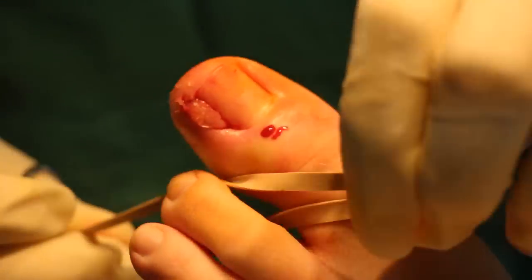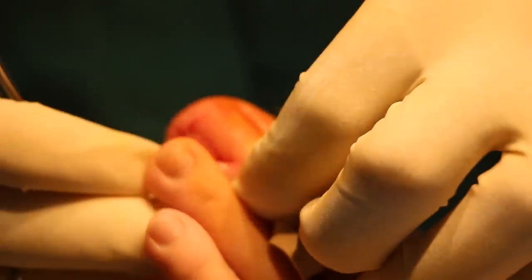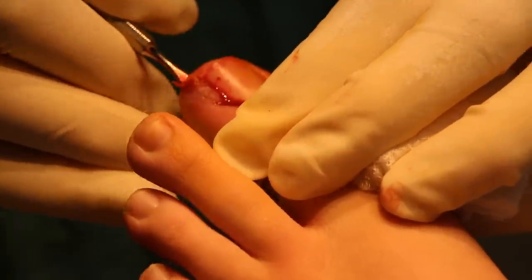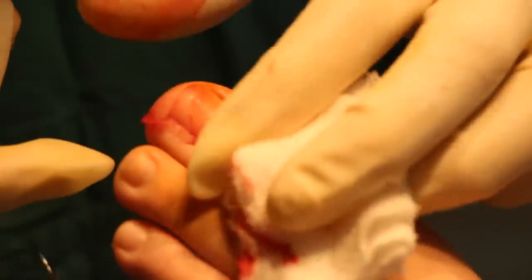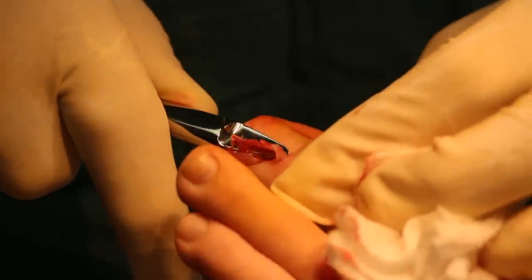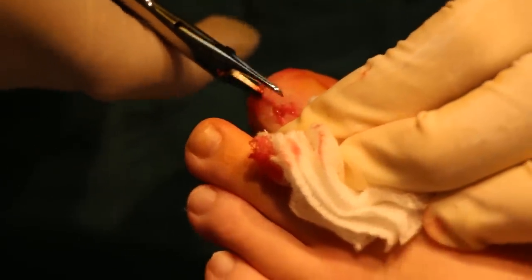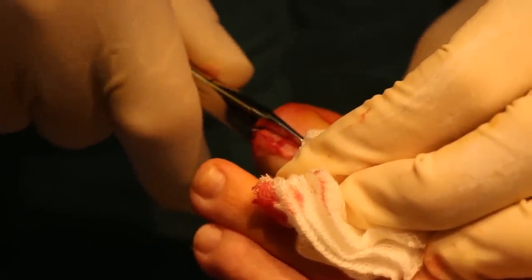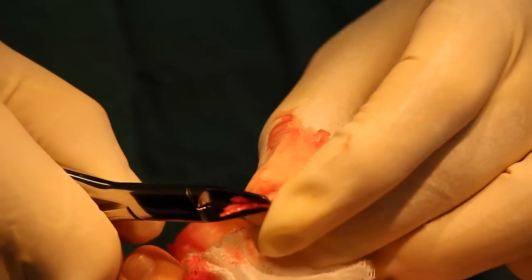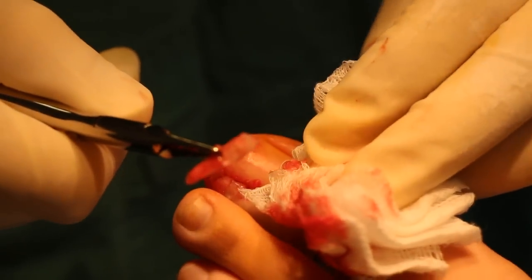Before I do that, I'm just going to put an elastic band around your toe. Let's make sure it's nice and numb. Does that bother you? No. How about this? No. Good girl. We're going to slip out the ingrown part of the nail, remove it, and the nail will be just a tiny bit narrower than before. And there it is — this was the part that was under the skin, and now that's gone.